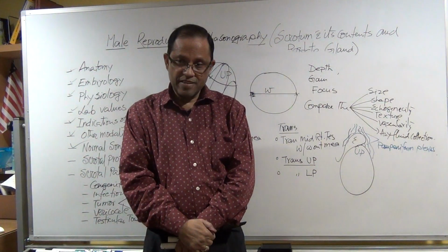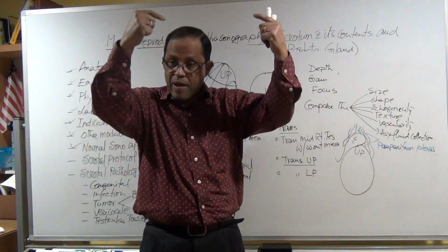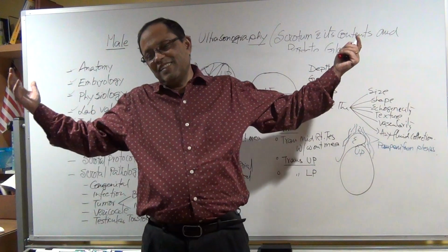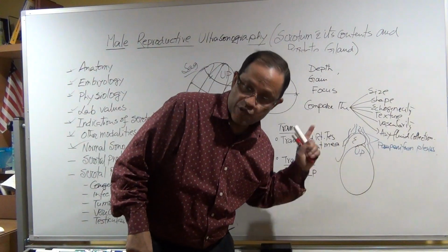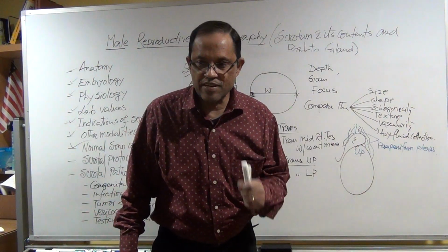What does it mean? During the Valsalva, there is a backflow and the valves are incompetent and the blood vessels are dilated. It indicates that the patient has varicocele due to incompetent venous valve.